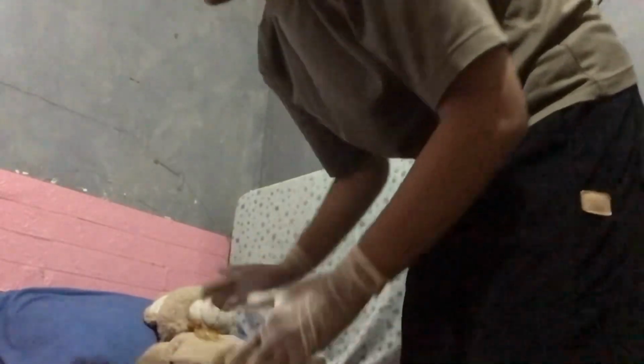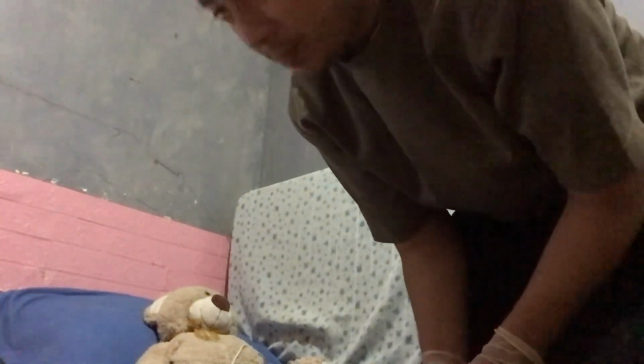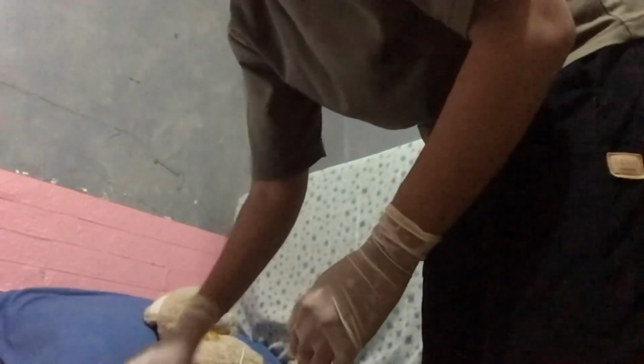So another procedure to check if the tube is in the proper placement, we must check in the abdominal X-ray. That is the gold standard.